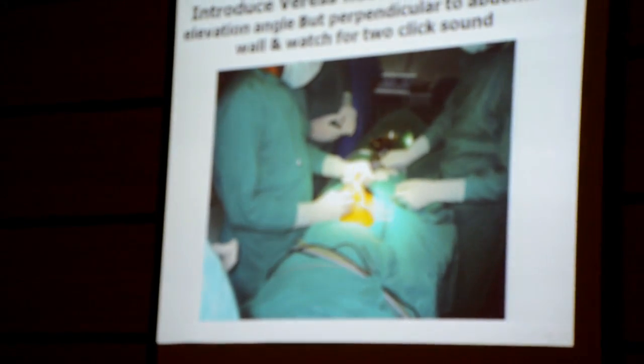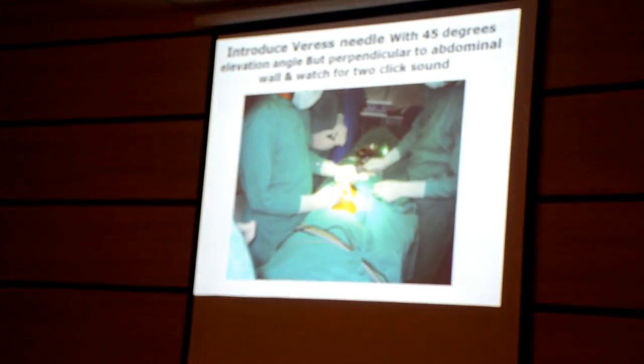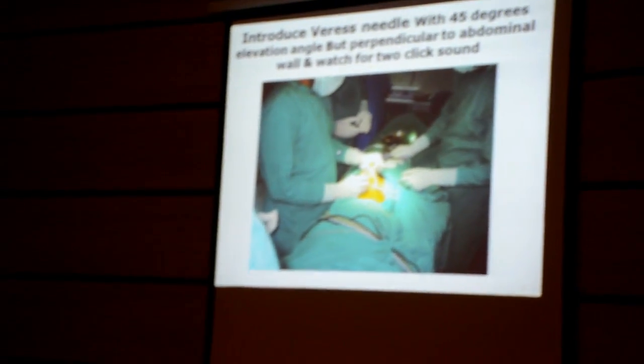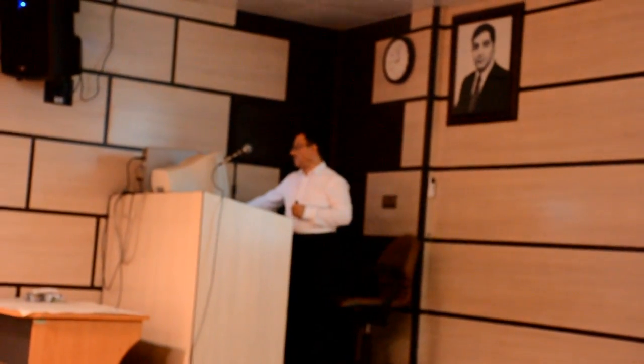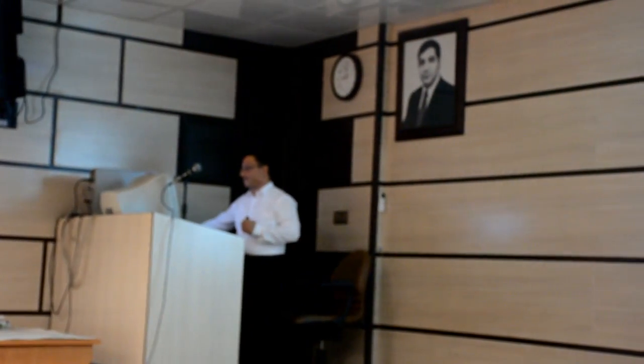The second is the sound of the peritoneum. But on the bilateral side, we hear three click sounds: two clicks for the sheath, anterior and posterior sheath, and the third one is the sound of the peritoneum. We feel the sound only here by hand. Yes, by hand.